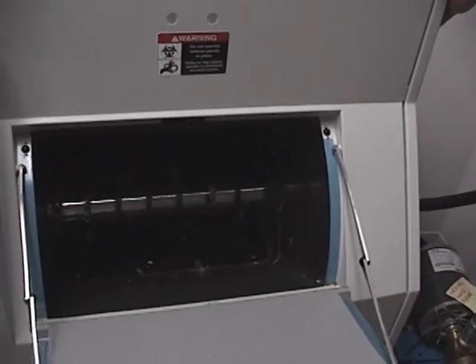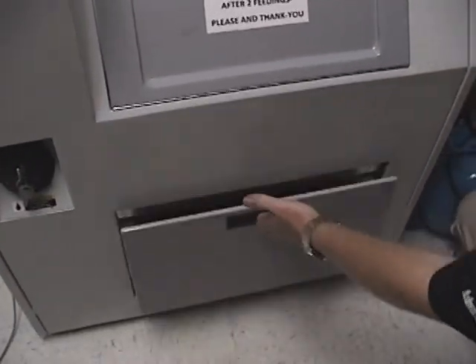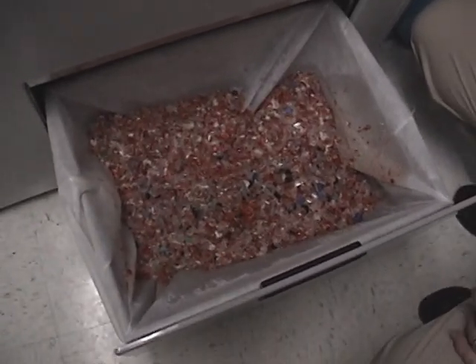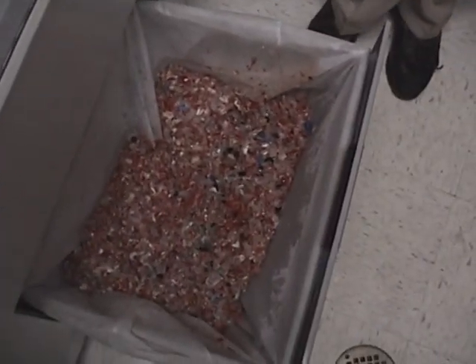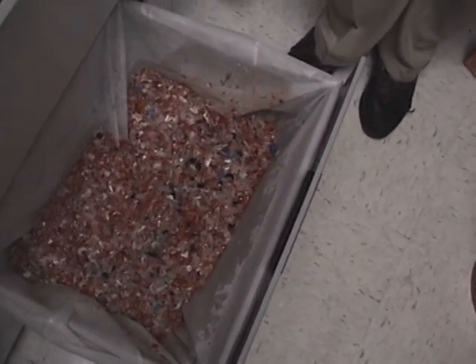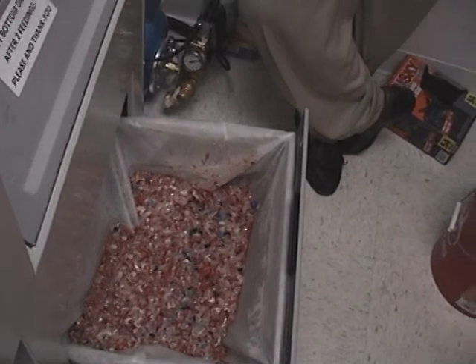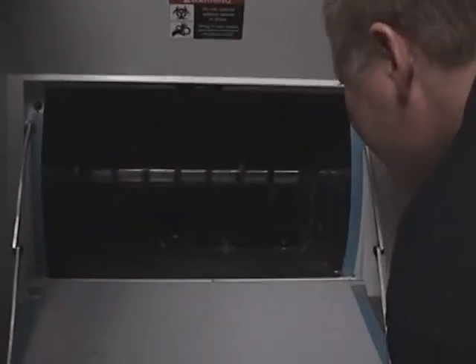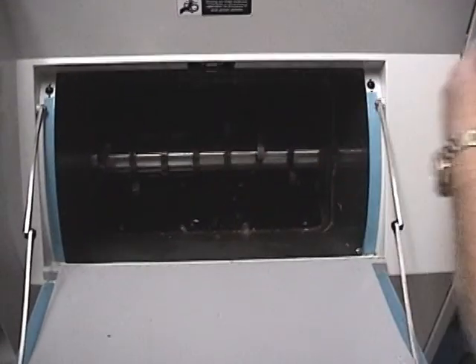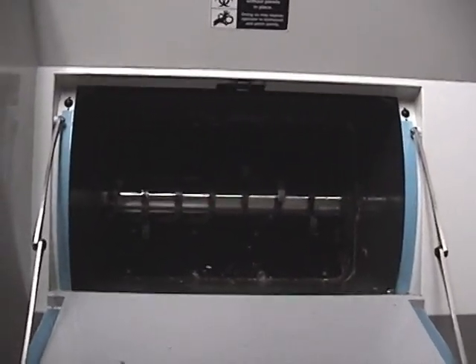There's a little bit of leftover liquid, a little bit of leftover debris, but nothing considerable. And then you've got a really pure result — and that is relatively dry. Some loads will come out quite saturated, but that's what the filter bag is for. You see the back holes — the metal pieces that have the holes — that's where the blades come back up and catch the plastic.